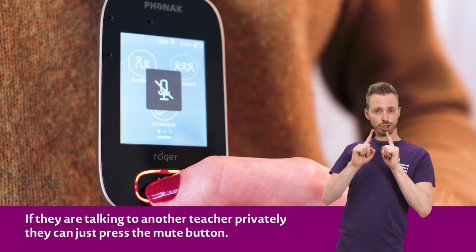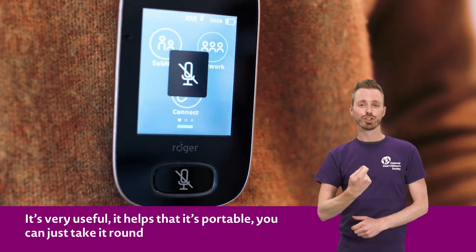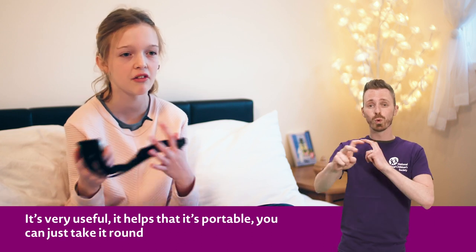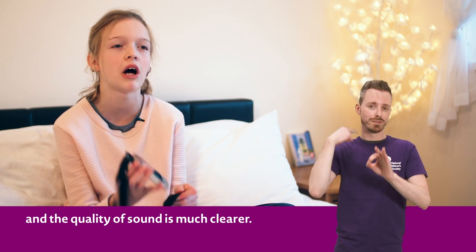If the teacher is talking to another teacher privately, they can just press the mute button. It's very useful, it helps — it's portable and you can just take it around, and the quality of sound is much clearer.